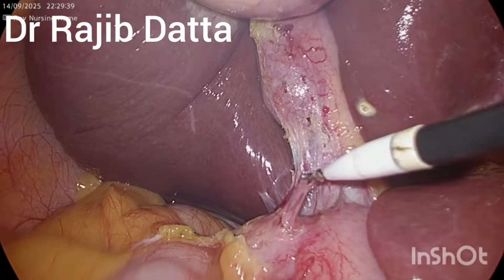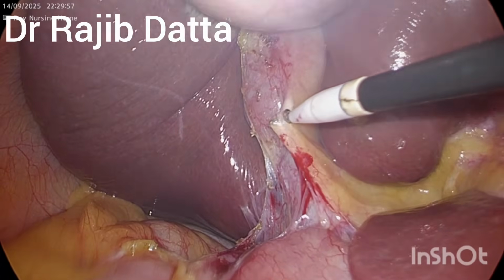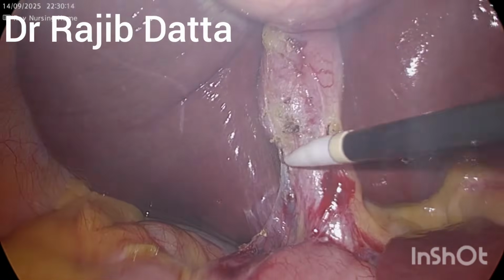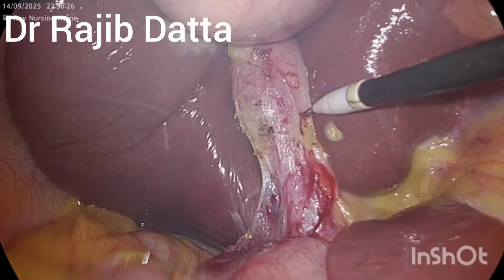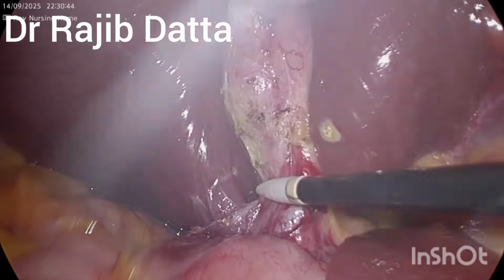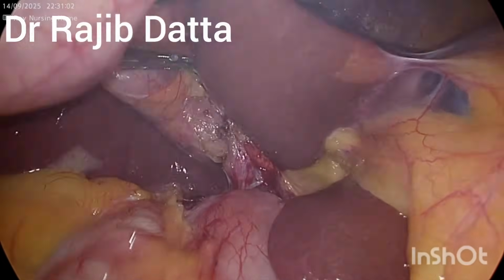We are now separating both the anterior and the posterior Calot's simultaneously. And here the fat plane has been separated. The cystic lymph node, the lymph node of Lund, will be visualized, and the CBD can be well appreciated. Now our target is the cystic pedicle, and the triangle of safety, or Strasbourg, is to be well visualized.